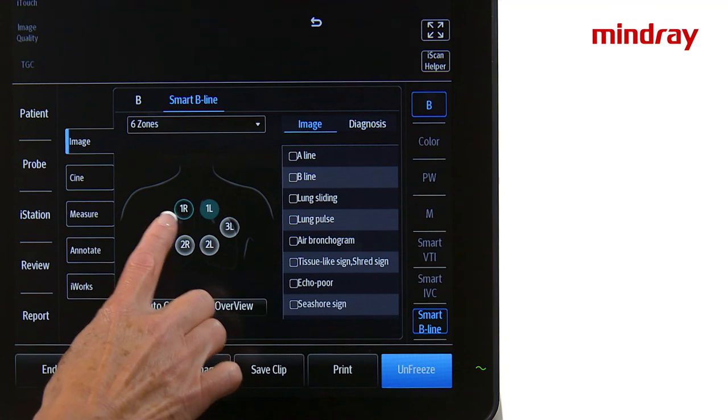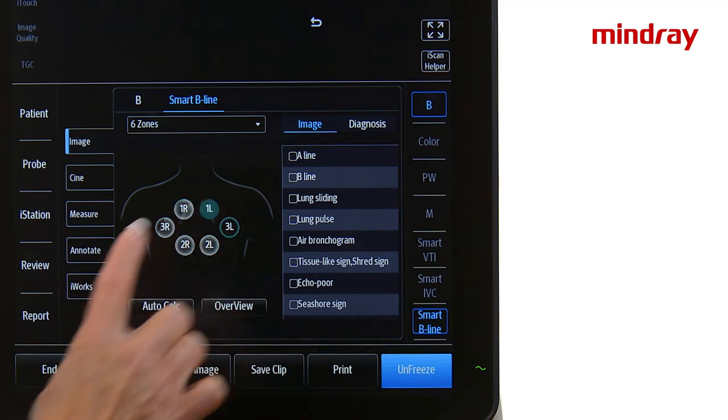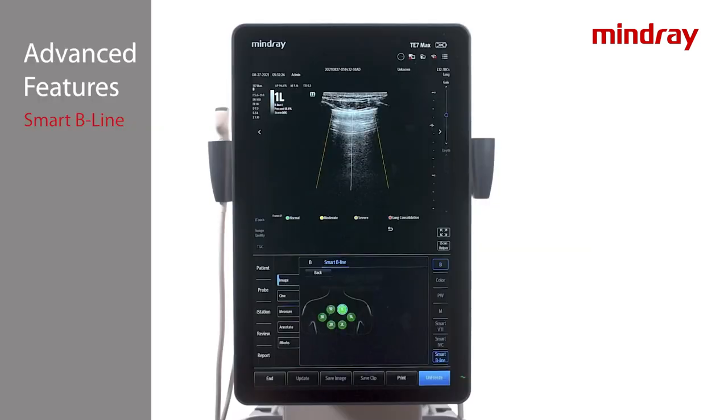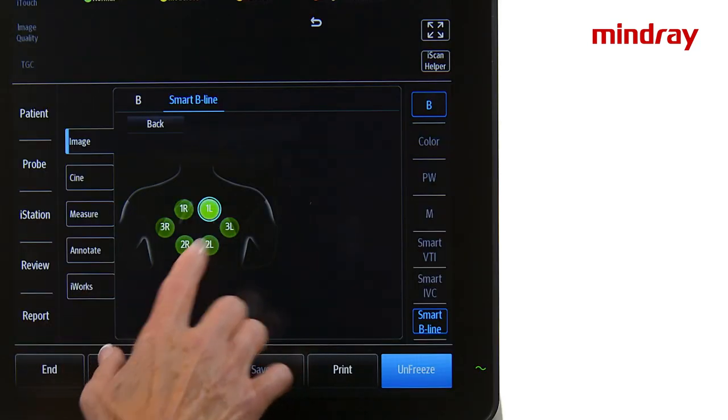Repeat for all lung zones. Quantitative indicators including B-line count, distance, and B-line percentage will be displayed in the top right corner of the image. When all lung zone images are completed, select Overview to review results for each lung zone.